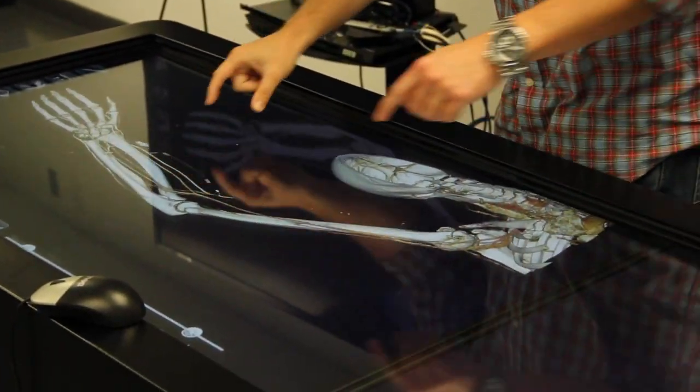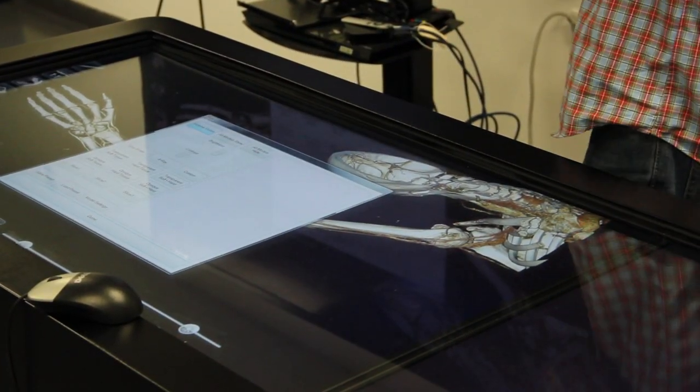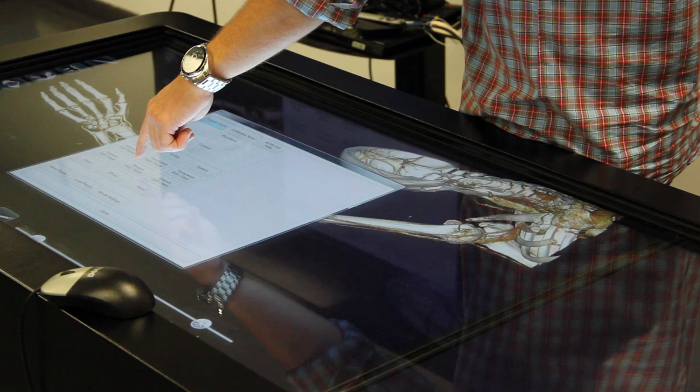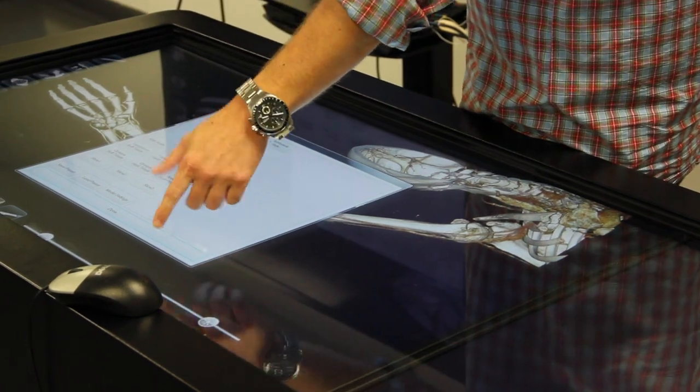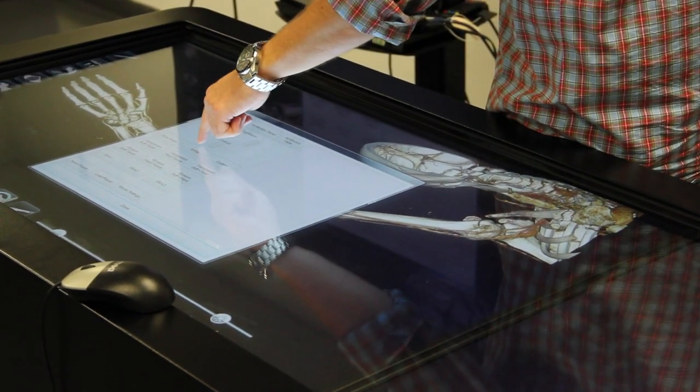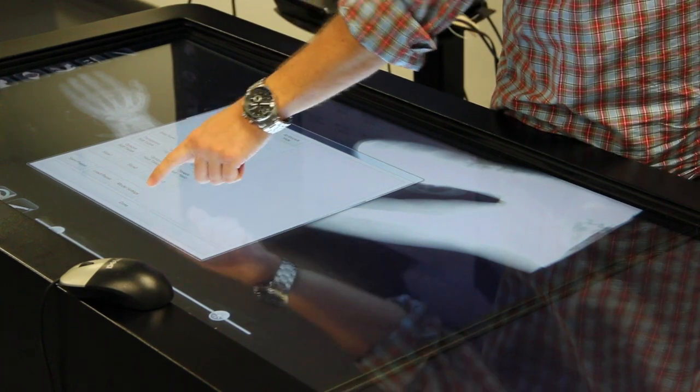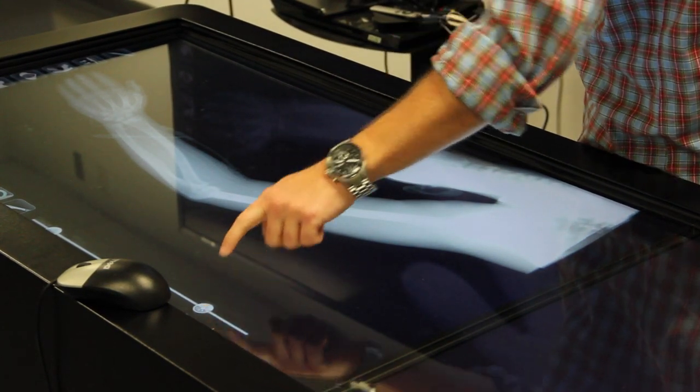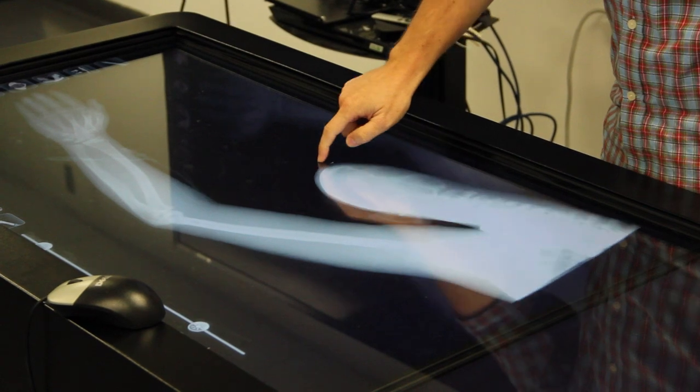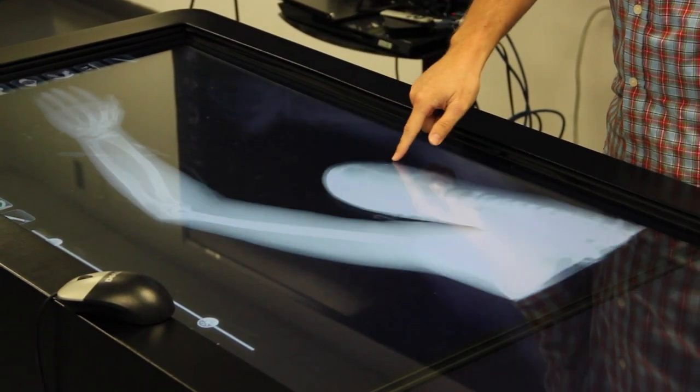Now one thing we can do with this as well is we can change the render setting. So this is what's known as the opaque hard tissue. If you hit the eyeball, it will open this up. We can change this to an x-ray mode. If I change the brightness a little bit, we can now look at that as a 3D interactive x-ray.